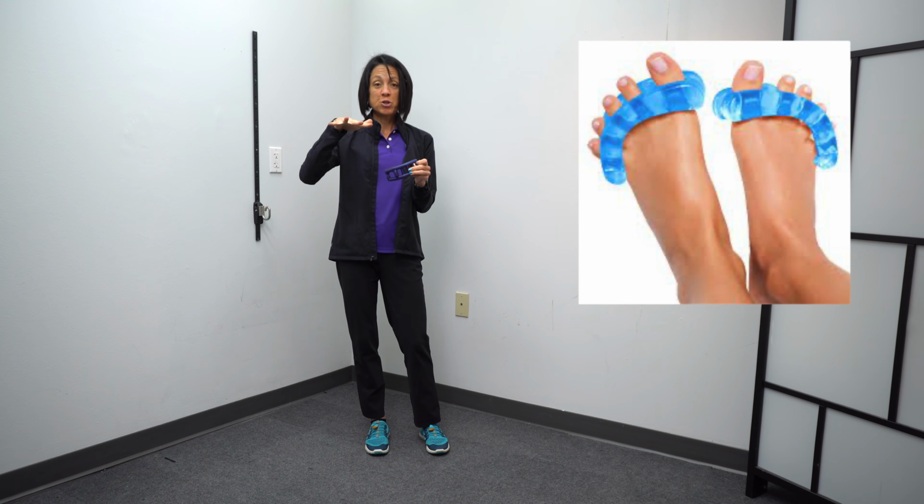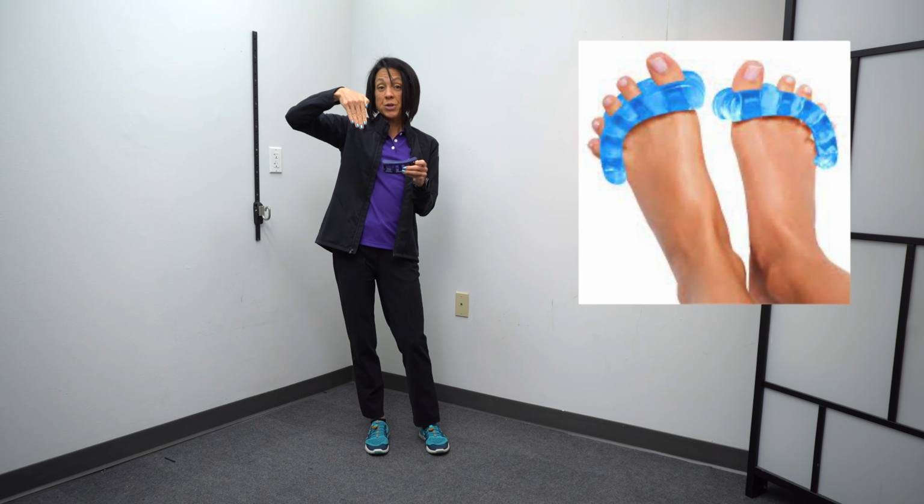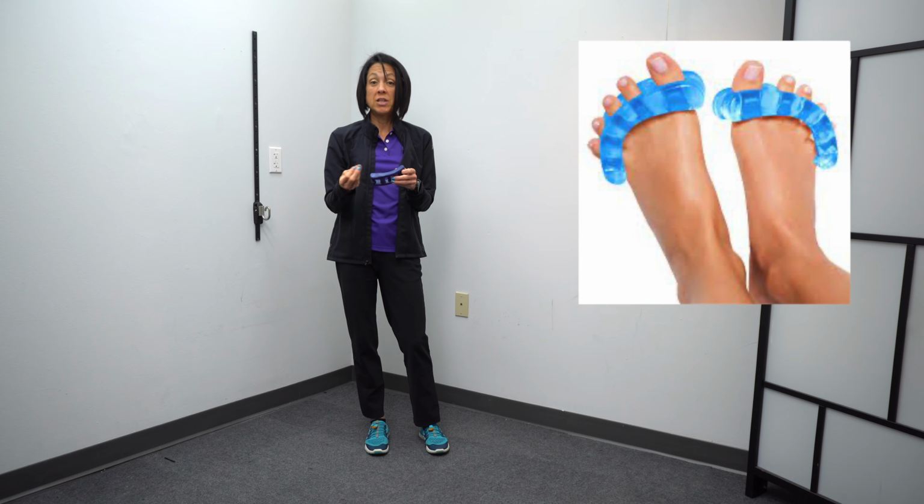All right, and then the final tool is a toe separator. So this is a fairly large toe separator. I really like this bigger version because it keeps your toes further apart. What a toe separator does is when you separate your toes, there is some kind of relaxation of the intrinsic muscles of the foot, which will stop toe curling. When you can prevent toe curling, sometimes that'll minimize the spasticity higher up in the leg.